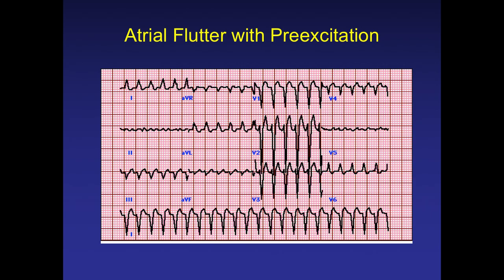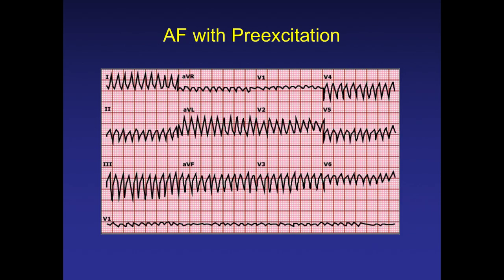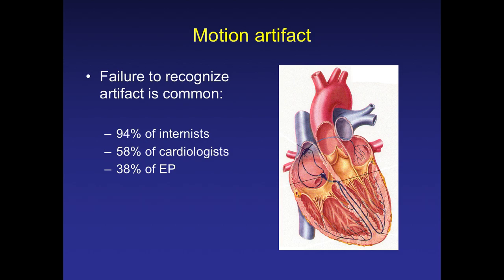There were examples of atrial flutter with pre-excitation already shown. The point of showing so many examples is that we should not panic whenever we see wide complex tachycardia. Applying basic principles, most of the time everyone can come to a diagnosis. This is a good case of atrial fibrillation with pre-excitation — if you look carefully at the RR intervals, they are irregularly irregular.